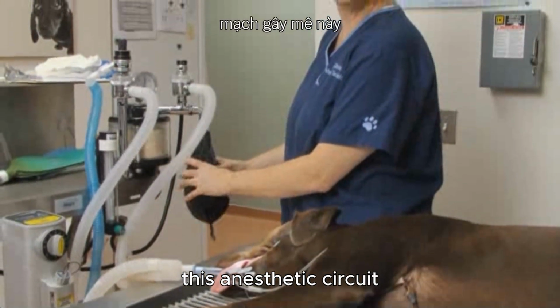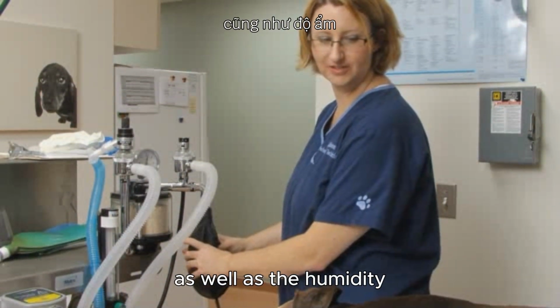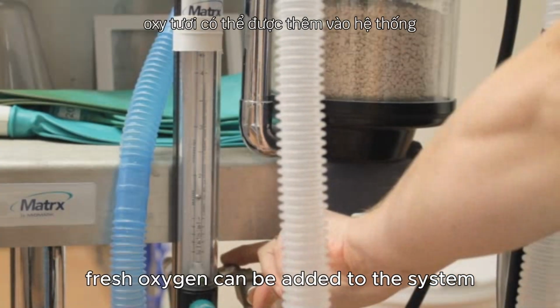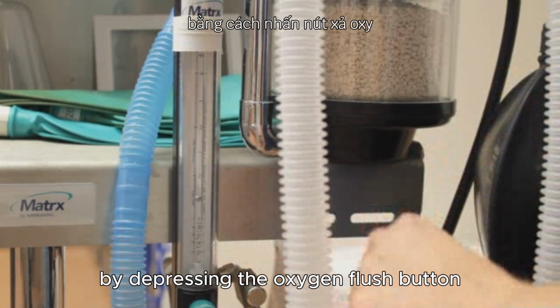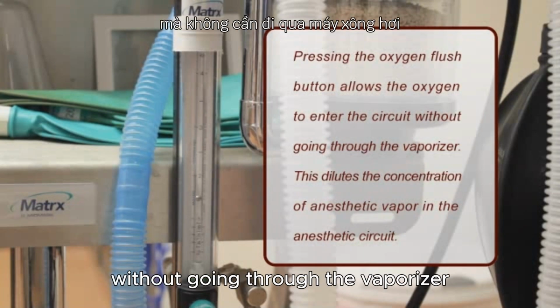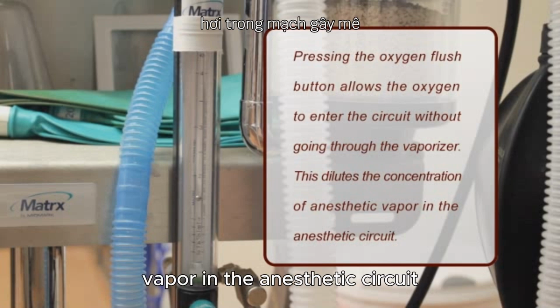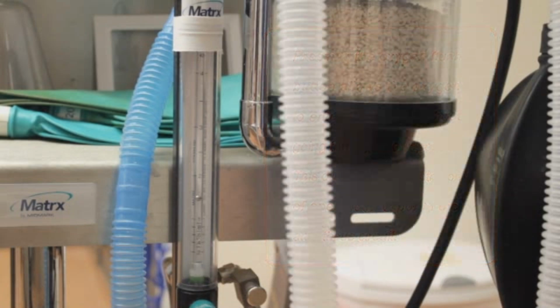This anesthetic circuit efficiently recirculates the anesthetic gases as well as the humidity beneficial to the respiratory system. Fresh oxygen can be added to the system by depressing the oxygen flush button. Remember, however, that pressing the oxygen flush button allows oxygen to enter the circuit without going through the vaporizer. This dilutes the concentration of anesthetic vapor in the anesthetic circuit, which could cause the animal to wake up.